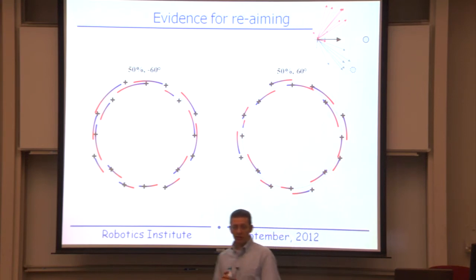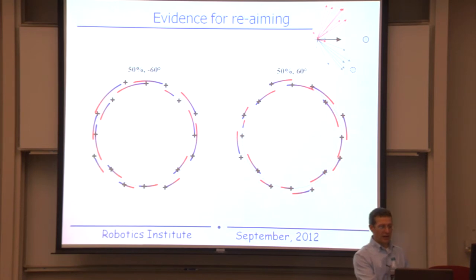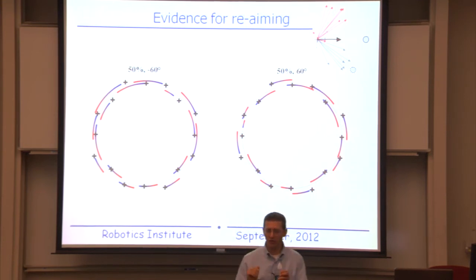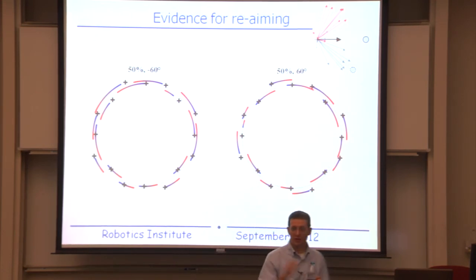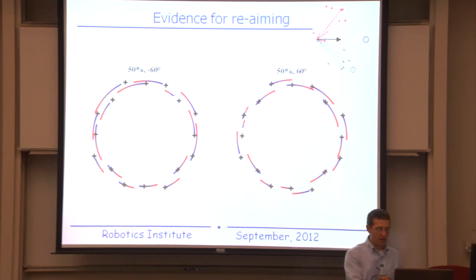So, which one of these strategies does the subject actually use? Well, he definitely uses re-aiming. And the way we assess this is we take the firing rates of the cells and we can perform a maximum likelihood estimate to find the aiming direction that best corresponds to those firing rates. And when we do that, what we find is that if these black pluses here represent the target directions, the blue ends of these arcs represent the aiming directions we measure during the control session before we apply the perturbation. And those aiming directions are always very close to the target. That's what we expect it to be. And after we apply a perturbation in the clockwise direction, what we measure is that the aiming directions rotate. That's represented by the red ends of those arrows; they rotate in the counterclockwise direction to compensate. And similarly, if we apply the perturbation in the counterclockwise direction, we see those re-aiming points move in the clockwise direction. So he uses that re-aiming strategy.